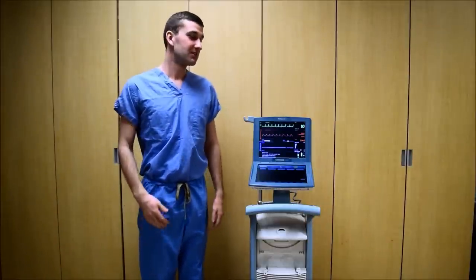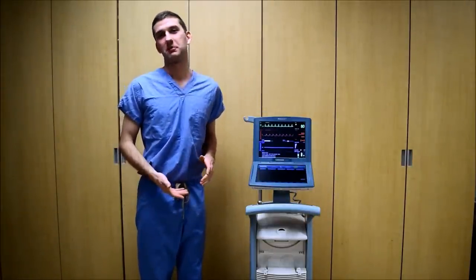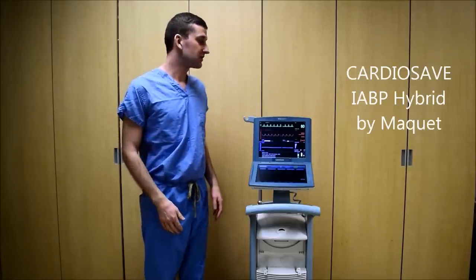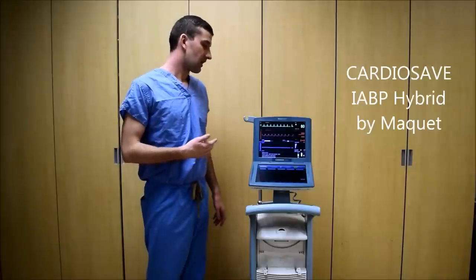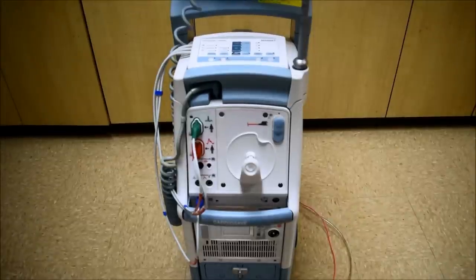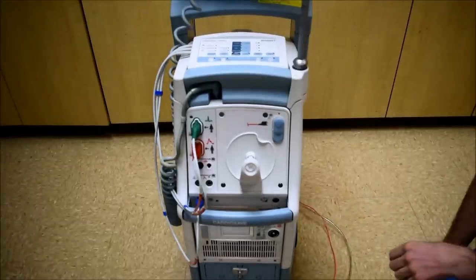Hi, Ryan Schmidt here. In this video I'm going to be going over some of the operations of an intra-aortic balloon pump. For this video I'm going to be using the CardioSave Hybrid by Maquet. Let's get started.